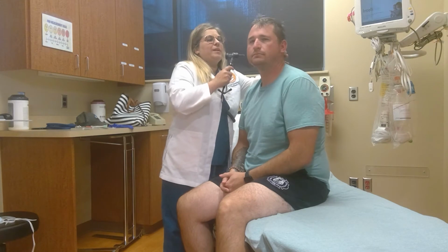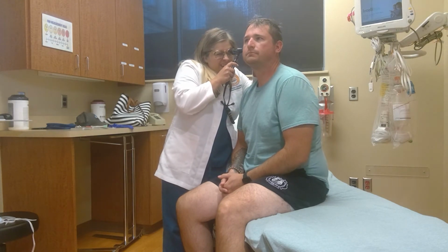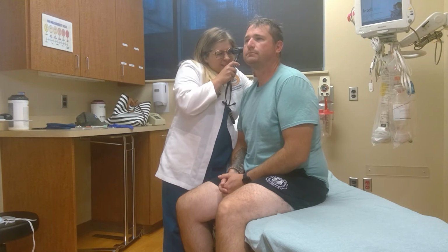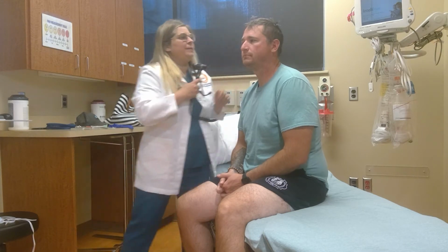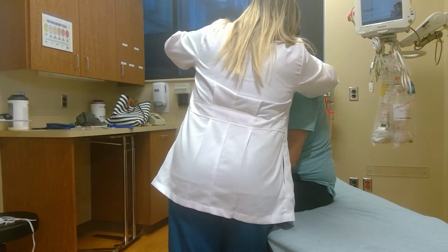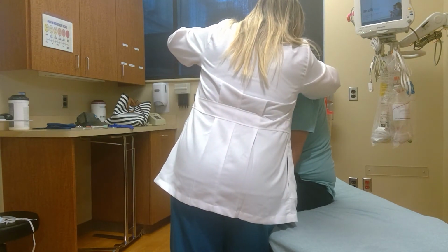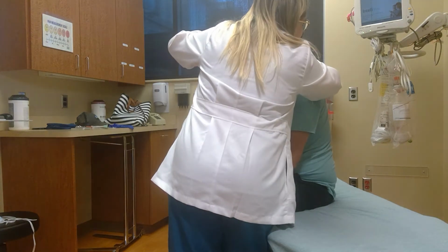All right, turn your head that way just a little bit. And down. All right, good. I visualize the canal, which looks clear. No redness. I visualize the tympanic membrane, which looks pearly. No bulging. Again, no redness. Great, and again, canal is clear, tympanic membrane looks pearly, no redness or swelling.